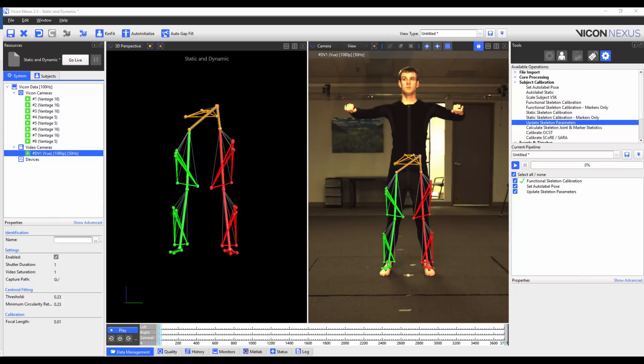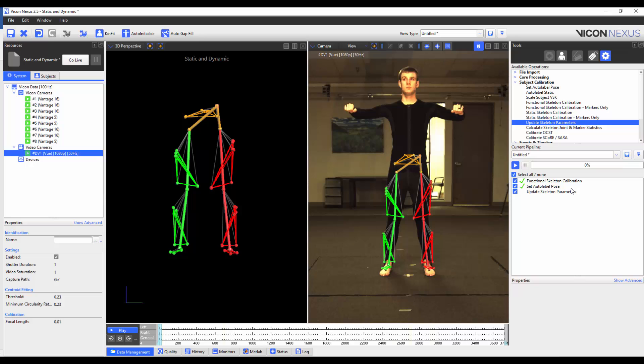Now I'm going to go to a frame where my subject is standing in the base pose, and I'm going to run the Set Auto-Labeled Base Pose Pipeline operation. As the name suggests, it is the pose that the Auto-Labeled Static Pipeline uses to properly identify a cloud of unlabeled markers.